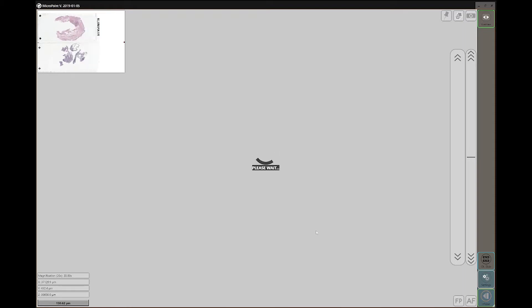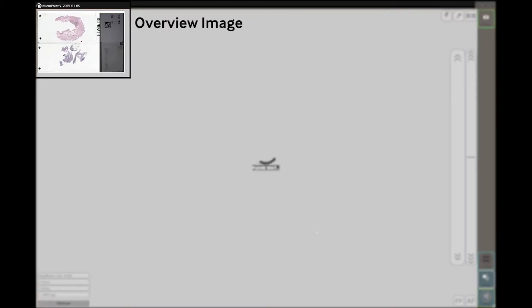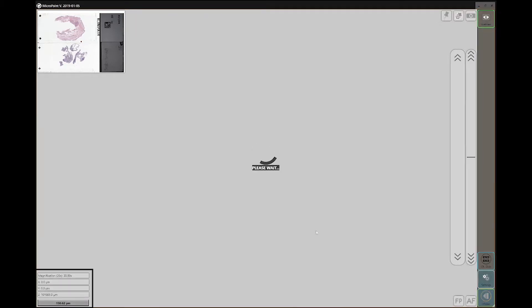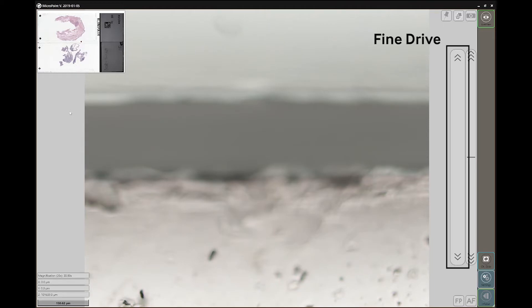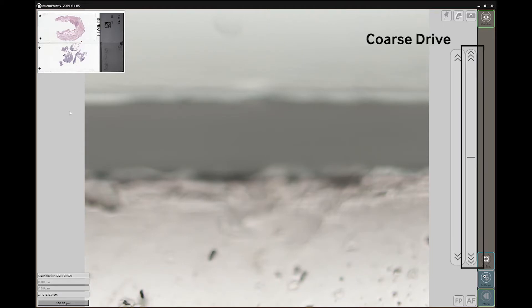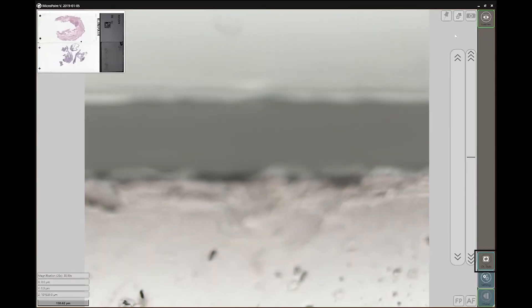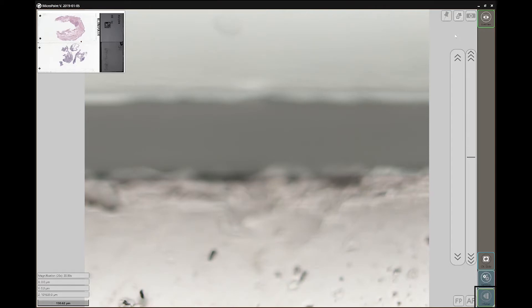Just like in instant scan mode, we have our overview image, where our exact position in the slide is shown. Our viewport image and our controls are on the left side, where you can see the magnification and our position details. On the right side, we have the fine and coarse drive. The button to switch between the different modes, the change slide button, the setting button where we can apply the illumination correction, which we show on our instant scan tutorial. And finally, our info bar, which we will see used later.